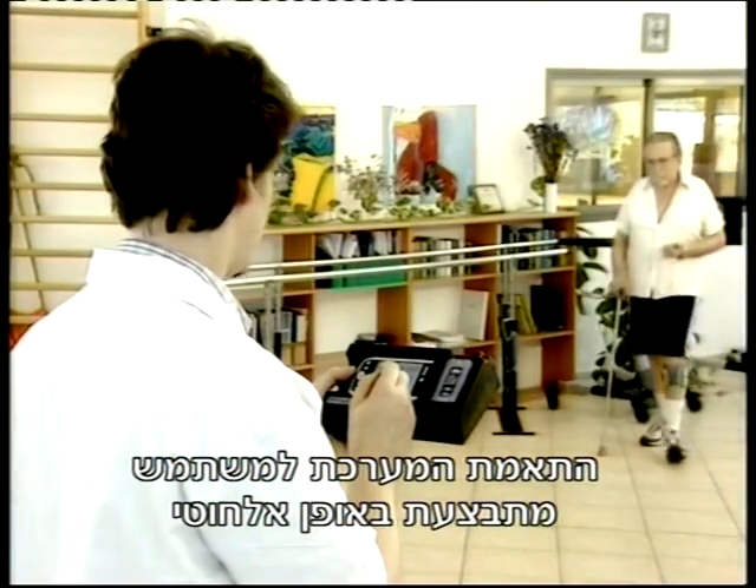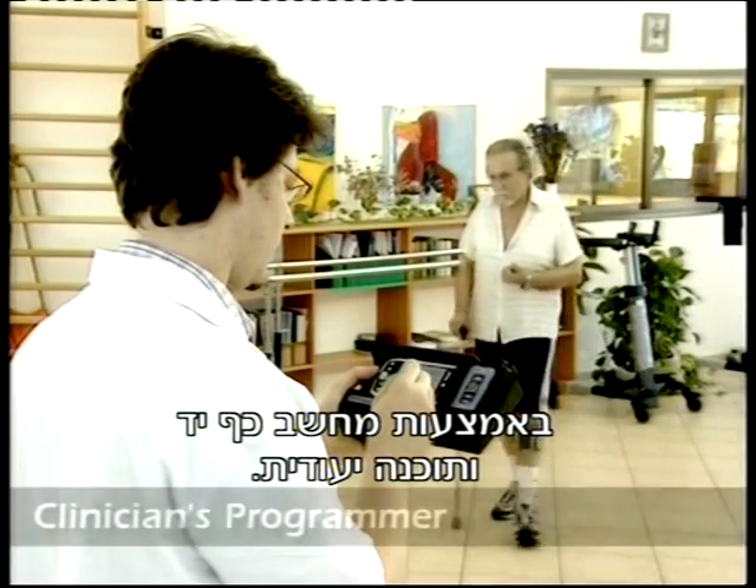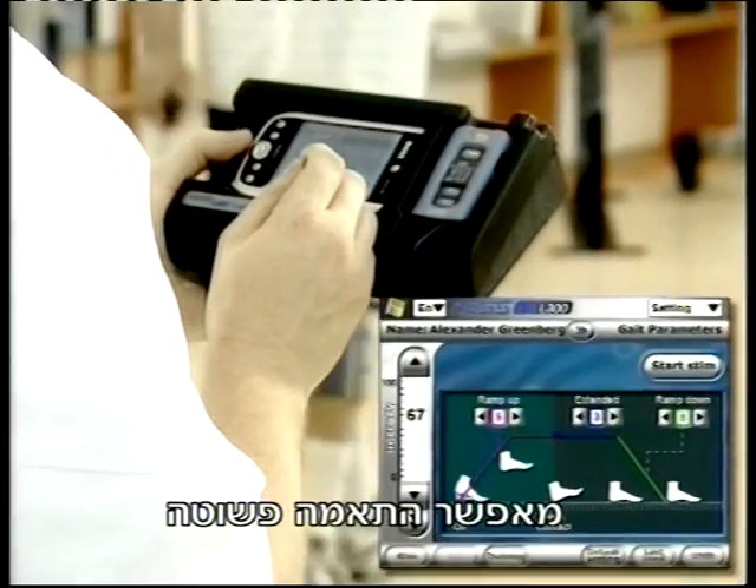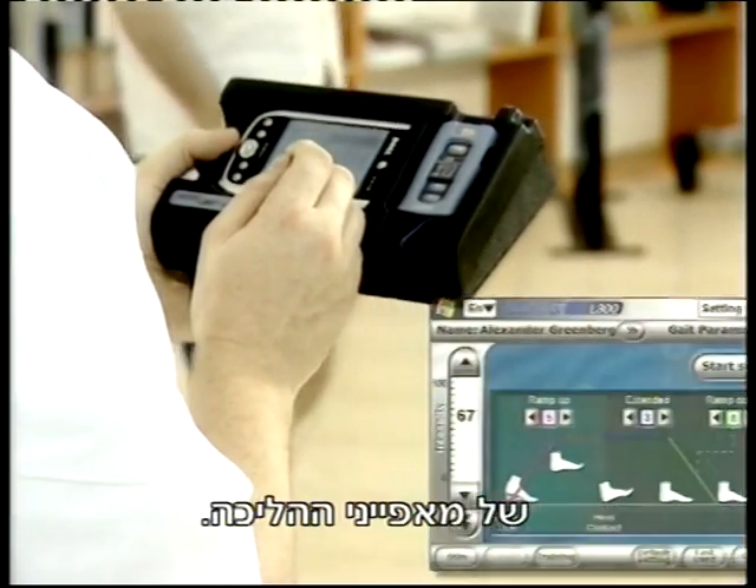Initial setup is performed wirelessly by using the Handheld Clinician's Programmer. Its intuitive interface enables simple configuration and online optimization of gait parameters.